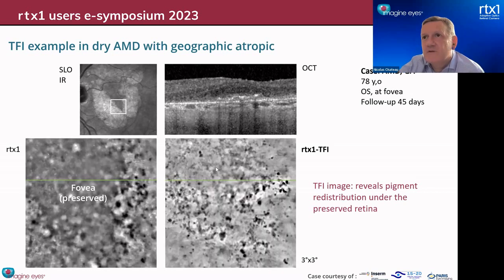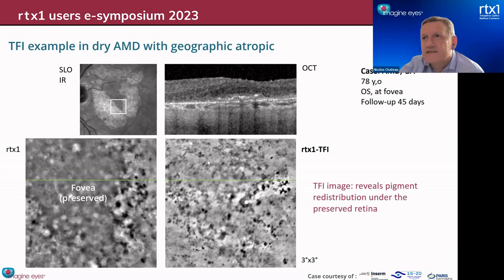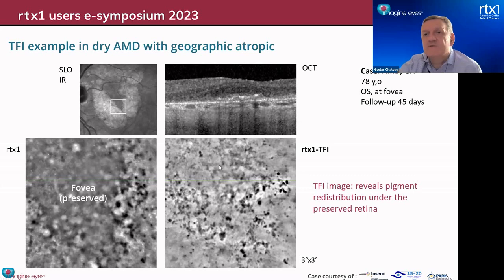And in the follow-up, here you can see, if you look at these 3 clumps, they become 2 clumps. So we also see this tendency of aggregating that Christopher mentioned before. This is all I'm going to show today, but the message is that this module is now available. I think we are going to deliver one very soon in Belfast. It has received the CE mark, and we hope several of your teams are going to use it and bring clinical data and make more new discoveries with this new option.